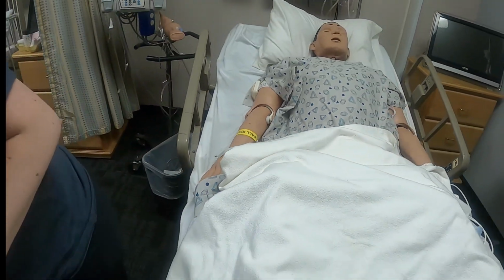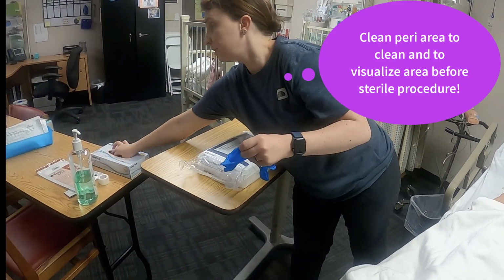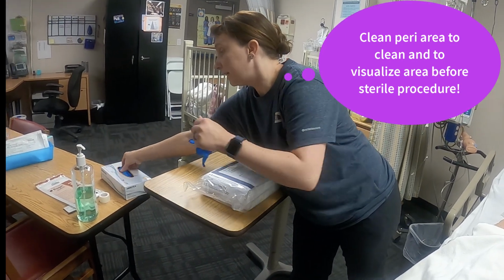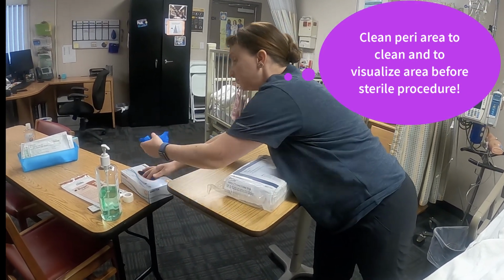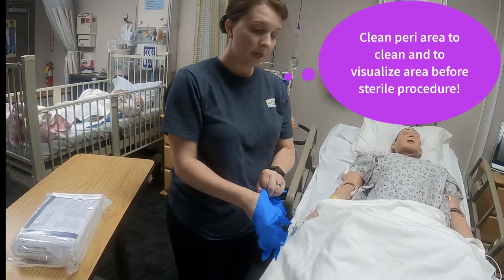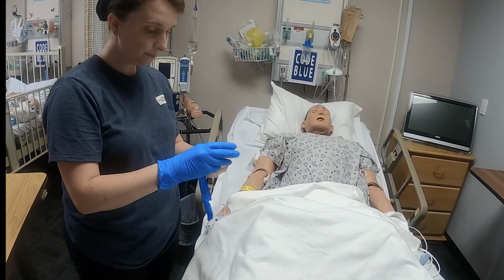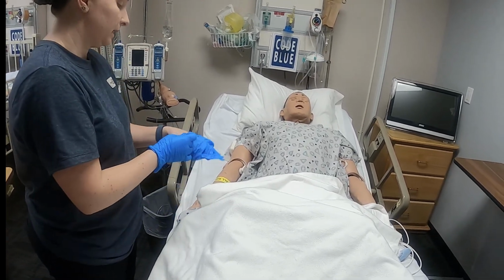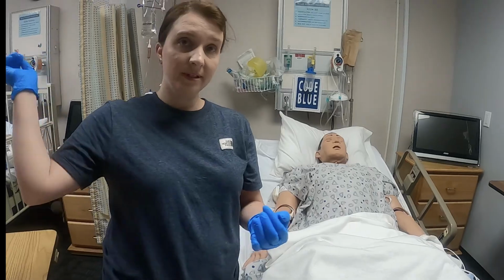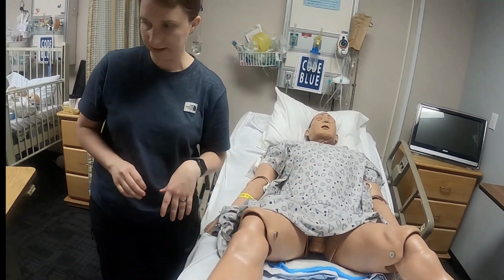So let me go ahead and put on some gloves. And first things first, we're going to provide peri-care. That way not only am I going to clean him this way, but I'm also going to see what I'm working with. Okay. I'm going to provide privacy. During that time, we can go ahead and just have him covered a little bit.